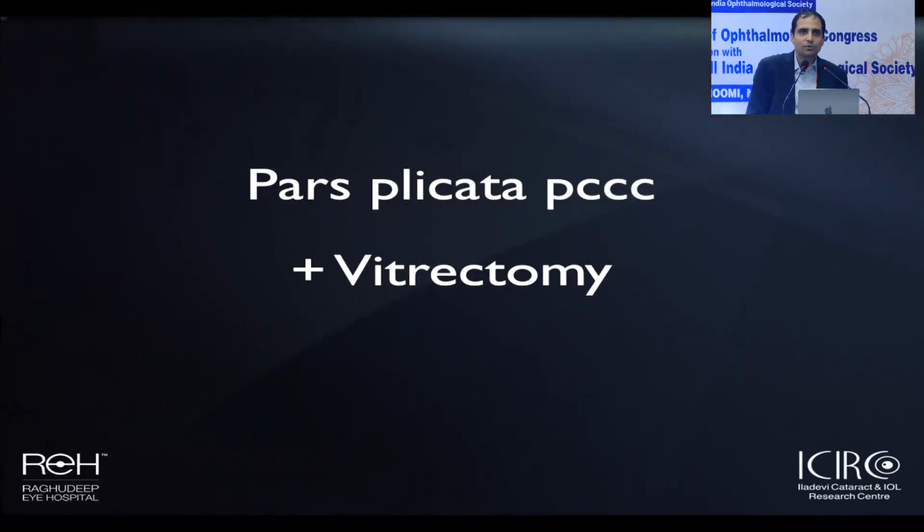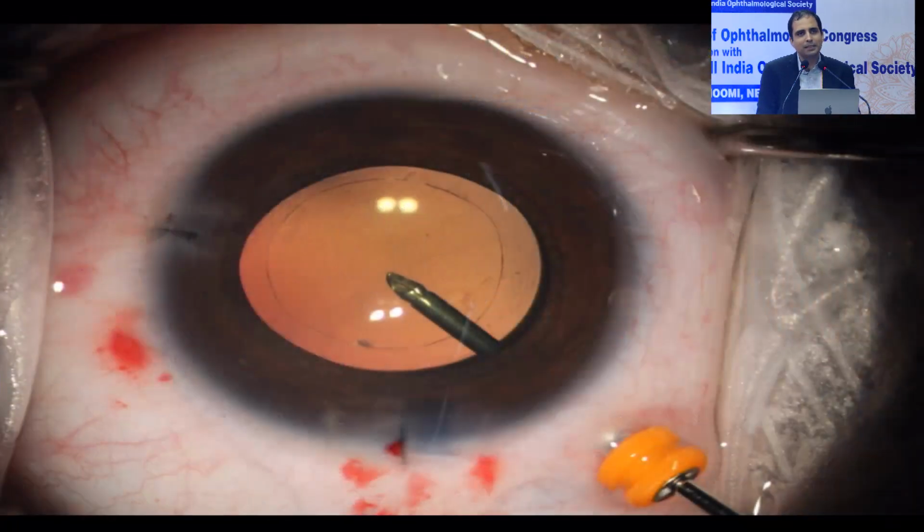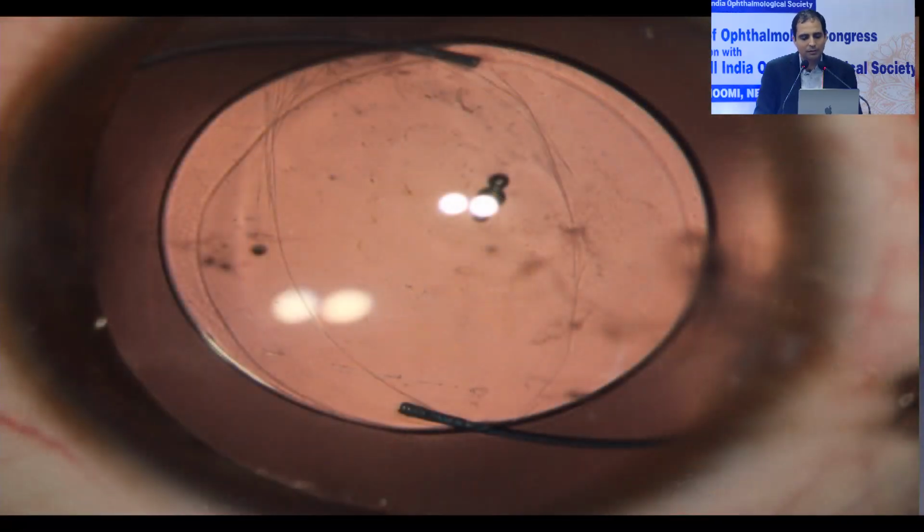Another option is to do even the PCCC with forceps through the pars plicata, which we published in 2011. This is something that we attempted and did for a while. It's not something that we would recommend very often, for the simple reason that you may end up disturbing the vitreous when you are moving with the forceps. It does cause significant traction.